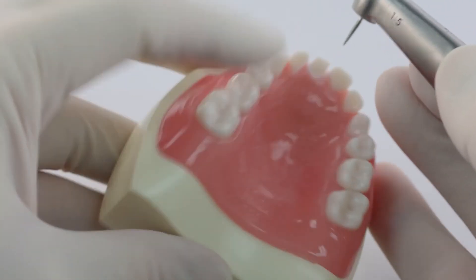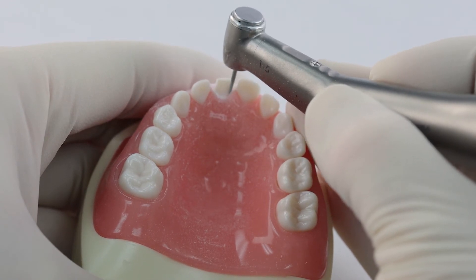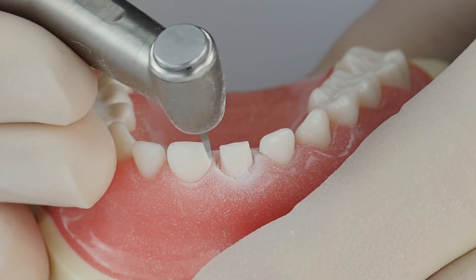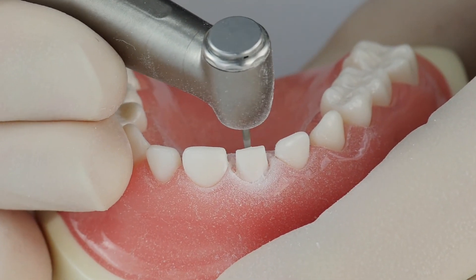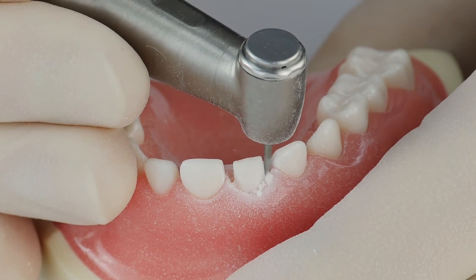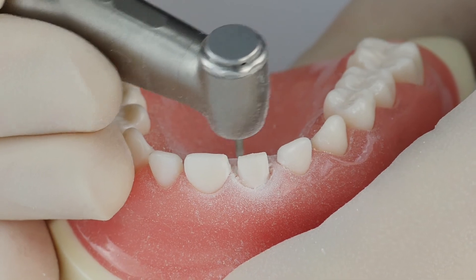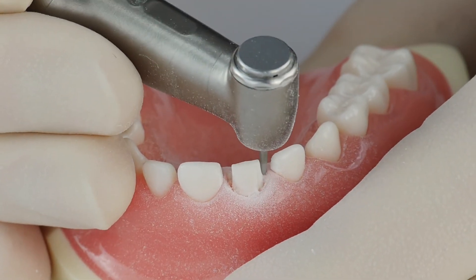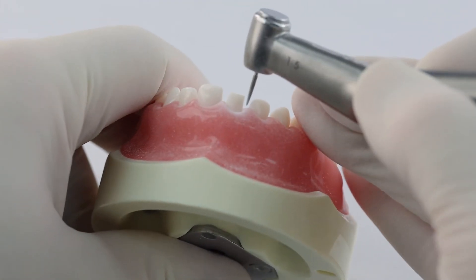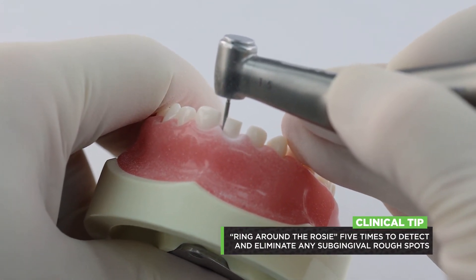Now I'm going to do the lingual, which is basically the same thing. We're going to come in just a little bit to start to peel away that ledge. Once that ledge starts to disappear, you can upright your burr more and then go in the required millimeter and a half to two millimeters. And when everything else is done, you're going to do the ring around the rosie five times — once again, angle that burr in just a little bit.